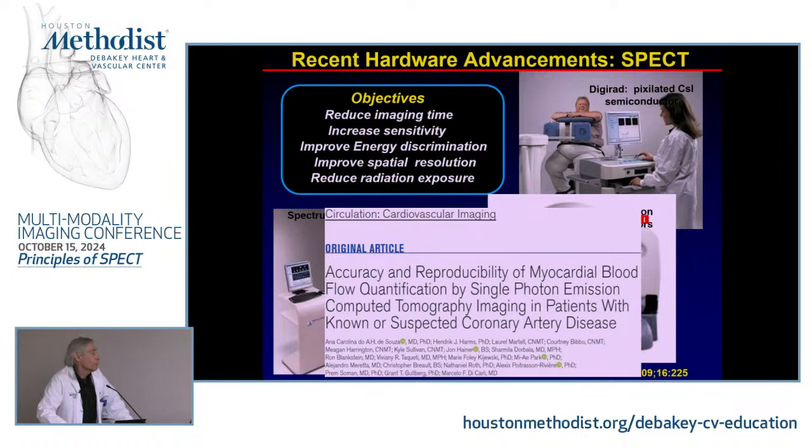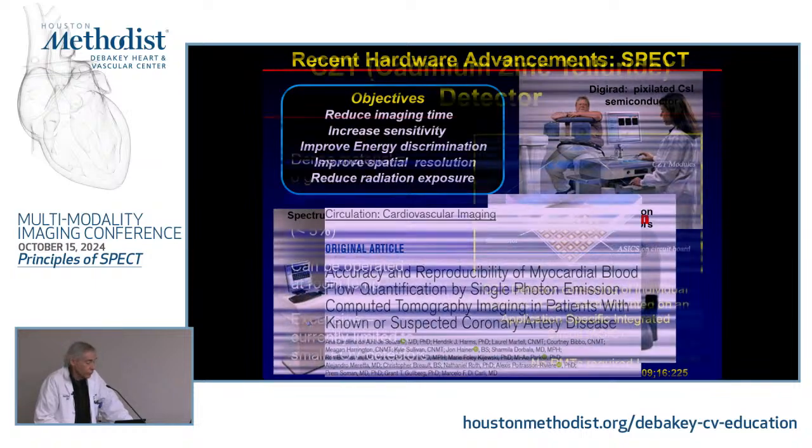And so there is the potential for looking at myocardial blood flow with SPECT imaging as we do with PET imaging, using technetium rather than a positron emitter like rubidium, by being able to accept enough counts to actually measure blood flow through the myocardium as it rapidly passes, which up until now has been very difficult with the kind of electronics and the kind of crystal acceptance rate we have in terms of photons.